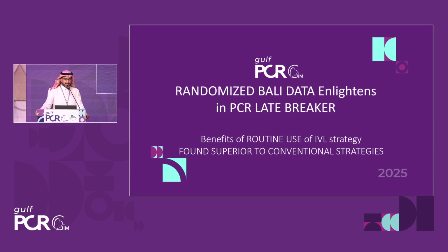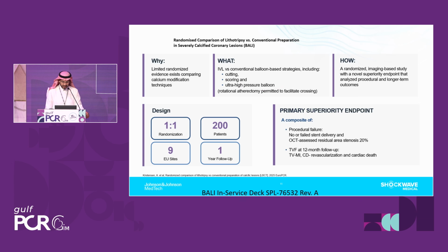Let's go to the second trial. This is the randomized BALI data presented in the PCR late breakers on the benefit of routine use of an IVL strategy, to compare whether it is superior or inferior to the conventional strategies. So is IVL the first thing that you draw from your shelf for a calcified lesion or not? That is the question. So it is obvious why we want to do this.